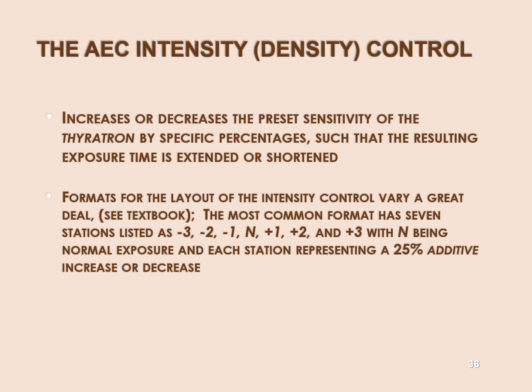So automatic exposure control. If you adjust the density button for increased density, the exposure is going to run long, your remnant beam strength is going to increase, but then if it's out of the range for the software, the software is going to divide all those intensities by 2 or by 3 or some other number.